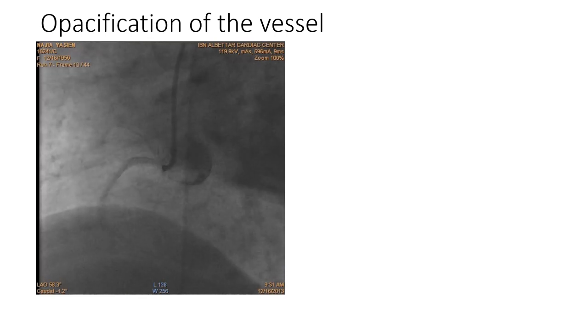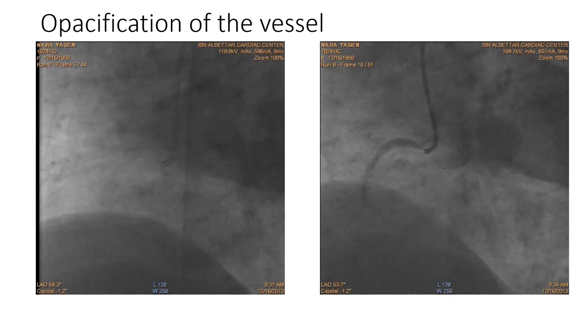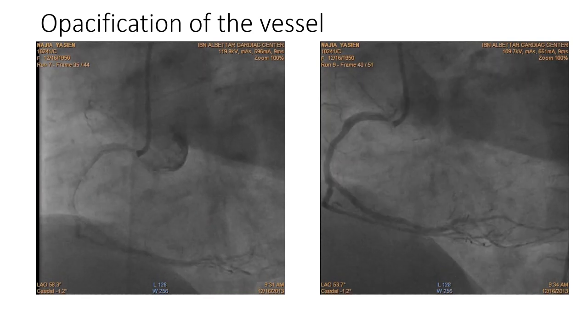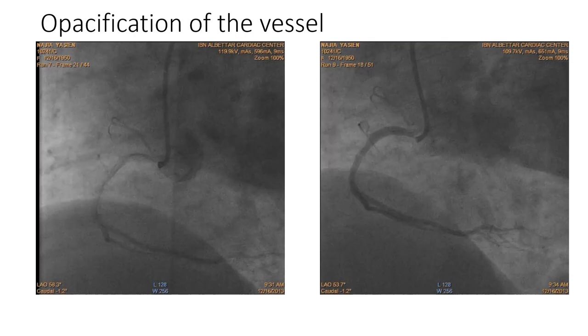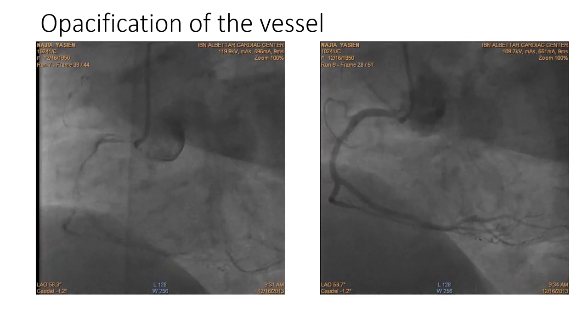Complete opacification of the artery is important to avoid misinterpretation of lesions. In this left-sided video, there seems to be a filling defect in the RCA at the mid part stent. Actually, this was due to streaming of the dye. In the right-sided video, proper opacification of the artery was done and showed that the artery is clear without filling defect.